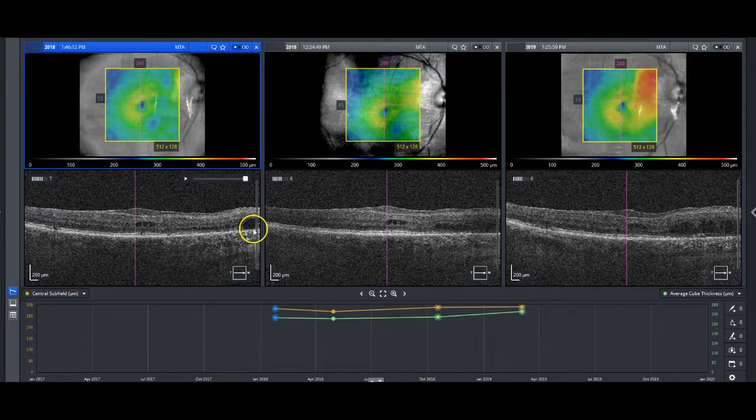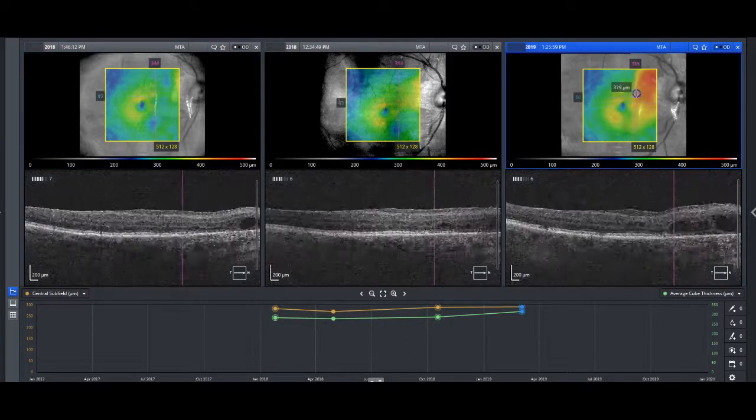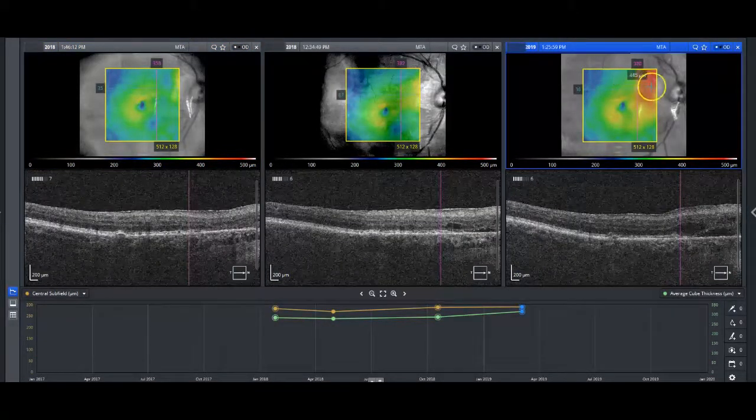This was much less. The patient was 20/30 vision at the time, and we didn't touch this eye in terms of any treatment. If you look over time, back in October, not much change, but then boom, March 4, 2019, what happens? The patient comes in, and you can notice very straightforward on the map that there's an area of increased thickening. Recall that that thickening is going to be measured from the RPE to the inner retina, and you can notice now more subretinal fluid and more retinal thickening.